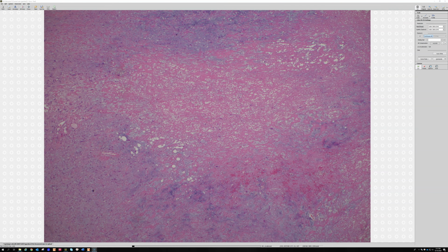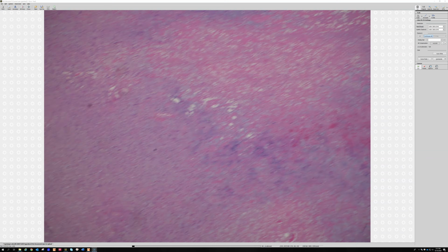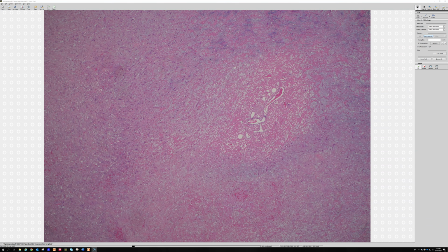Then the response around the edge of it is all reactive, reparative, fasciitis-like reactive myofibroblasts and granulation tissue and scars trying to kind of repair around that central zone of dead tissue. That's the way I kind of conceptualize it. This is the ischemic center, and all the stuff around it is kind of reacting to it.